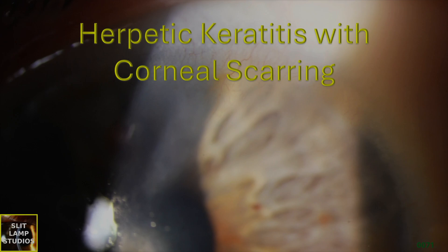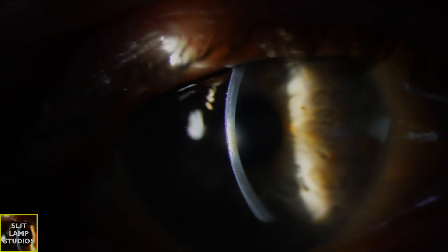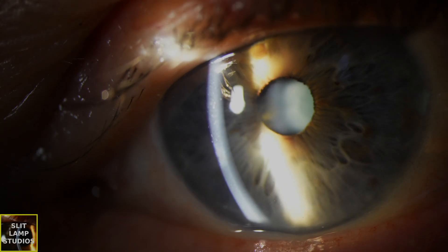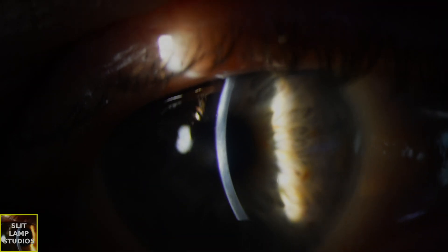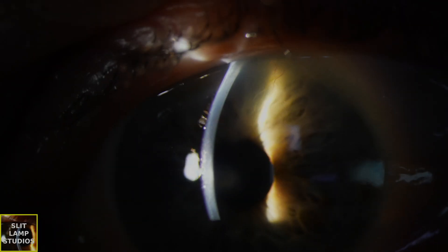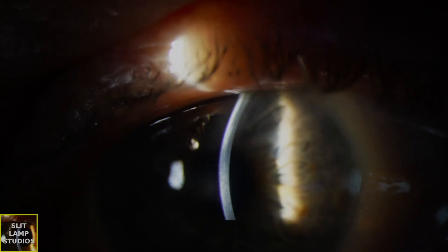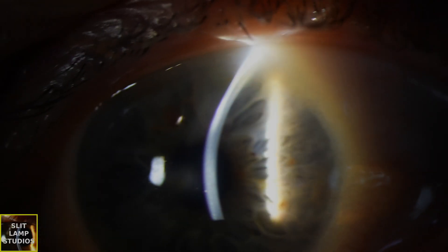Herpetic keratitis with corneal scarring. Here we have a slit lamp video of a 40-year-old male patient who's had recurrent previous episodes of stromal herpetic keratitis.